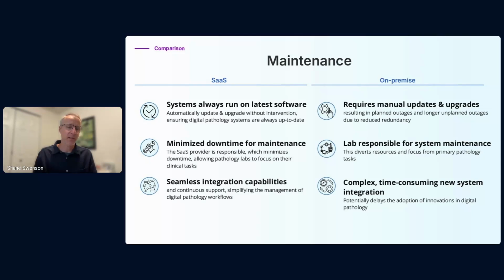Also, from an integration standpoint, whether it's integration with other cloud-based vendors or integration with your on-premise systems, those can be integrated and updated on an as-needed basis. When you look at maintenance of on-premise systems, of course, you're responsible for doing this internally, which often means scheduled downtime, taking the application down, making a set of updates, bringing it back up, validating it, and then proceeding. And this becomes a complex source of additional mindshare and additional personnel in the organization performing these updates.